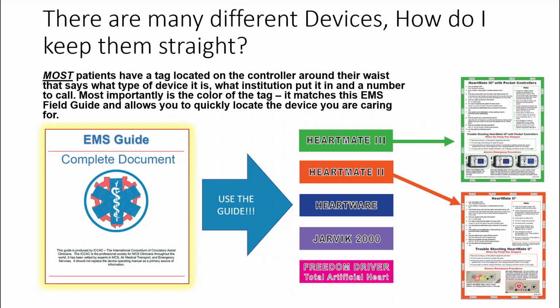These are the guys that, in addition to LVADs, run intra-aortic balloon pumps. These are the guys that help with ECMO and a whole bunch of other things I'm probably not even aware of. And they put out this guide, and attached to CE, I have the latest version, which I think is 2021. And they have a color coding system for these.